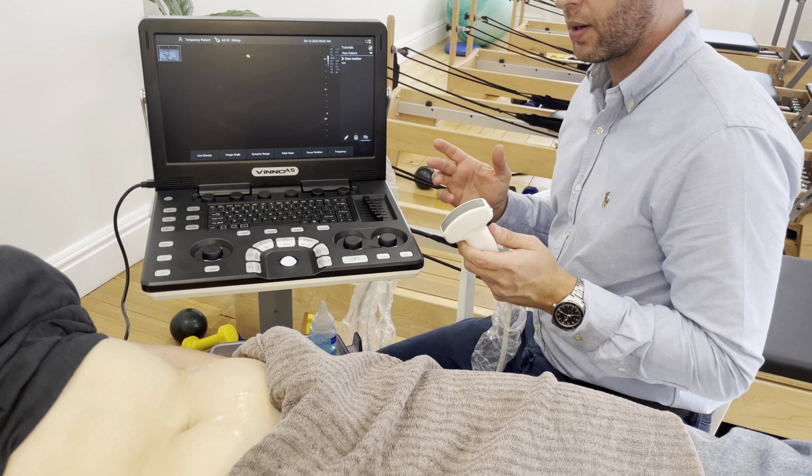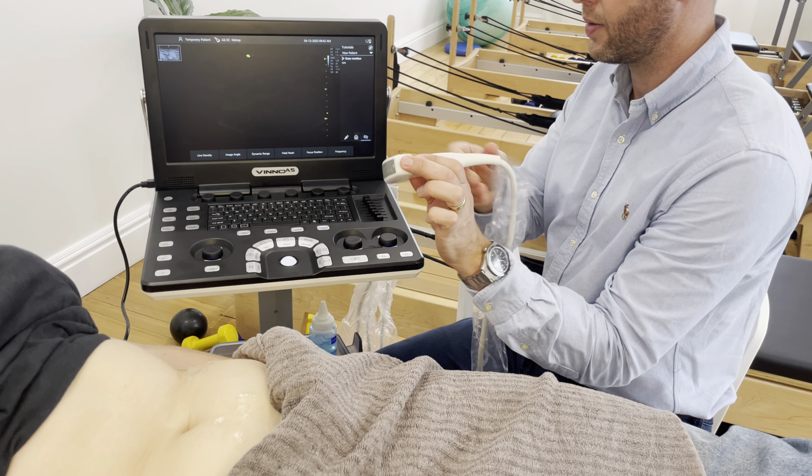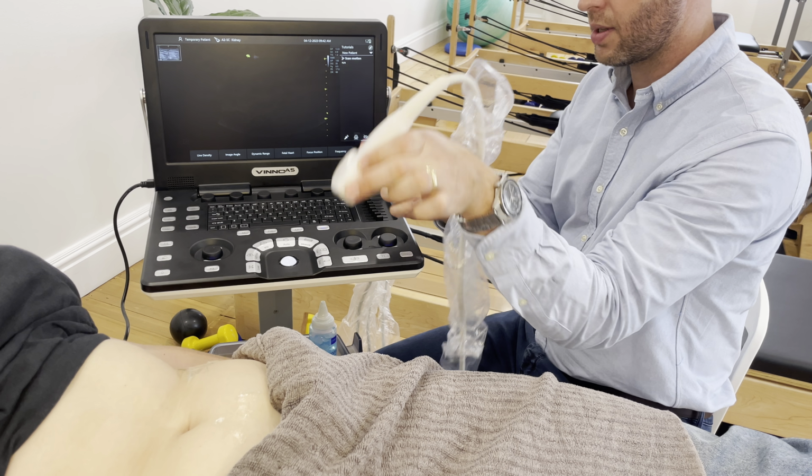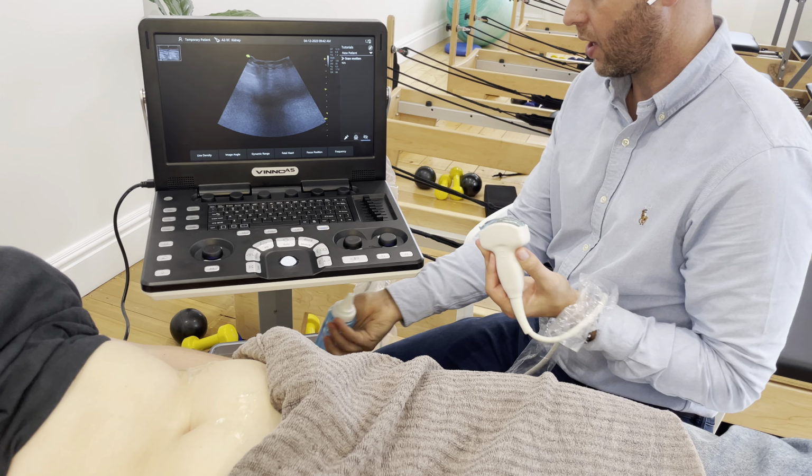So if we're going to take a look at pelvic floor, we're going to again start in the transverse plane, and we're going to have this little marker here towards the patient's right. So left of the screen is patient's right. We get a bit of gel on there.